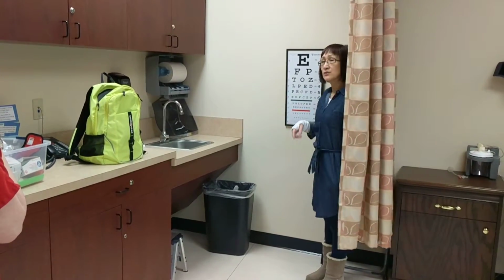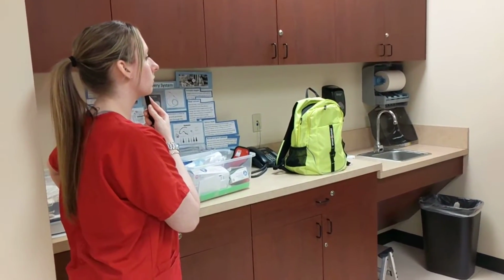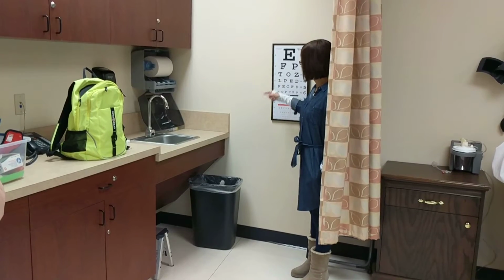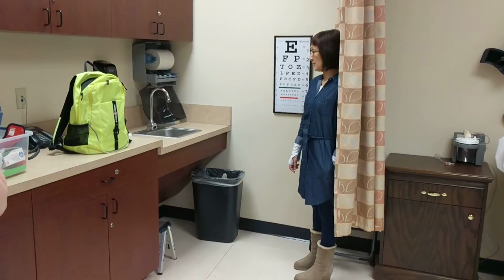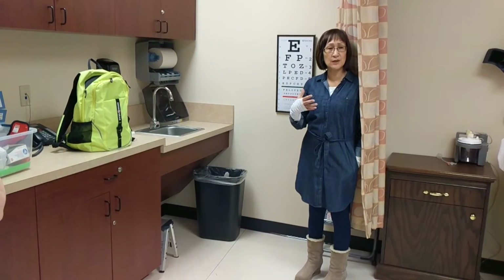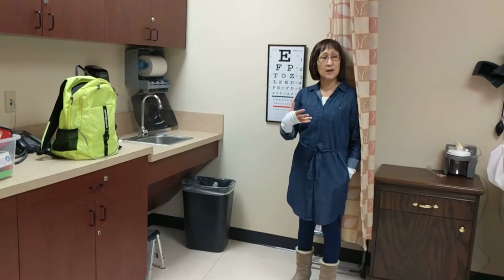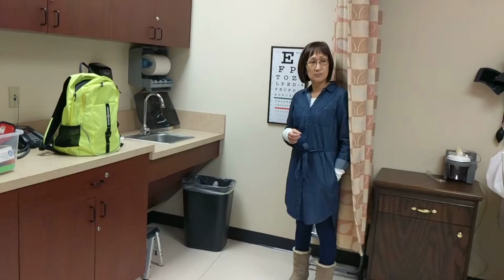Okay, now let's do the other eye, please. So the number with the smallest line you can read? Same line. Okay, can you read the letters, please? L-P-E-D. Okay, so for the right eye, it's also a 20 over 50. Can you read line 5? No. Okay. Now, when you're assessing your patient for the distance vision, make sure that they're not squinting, not pressing forward. They have to be very relaxed when they're looking at it. Okay? All good? All right.